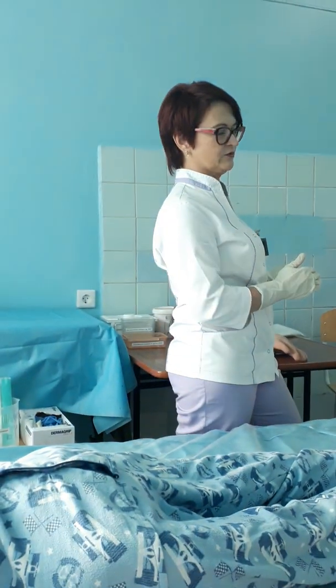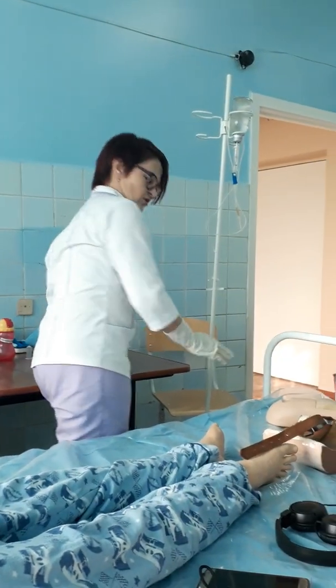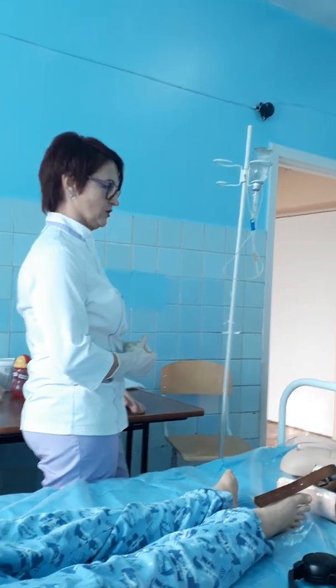What position for intravenous infusion will you use? In bed. Yes, flat position. Resting. Please lay on your back.